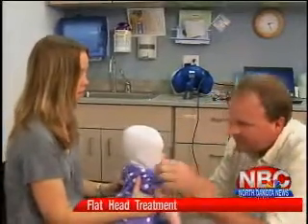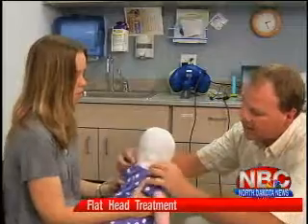where people would hold the patient down in order to get a plaster impression. Once you get the plaster on, you had to hold that and mold the back and front of their head to get a positive model to work from. And once you get that plaster over their ears and up over their eyes, it's wet, it's cold, and then it starts to activate so it starts to warm up.